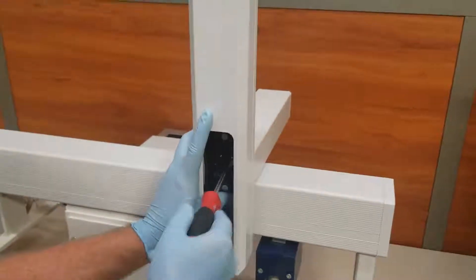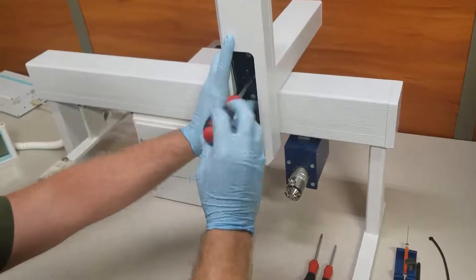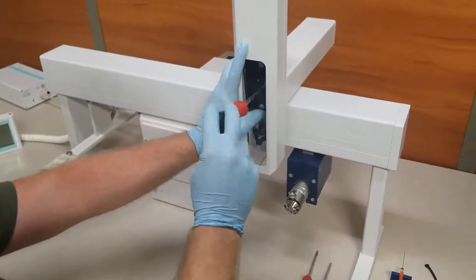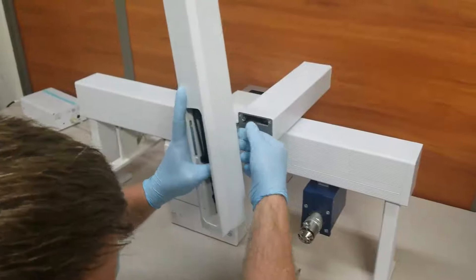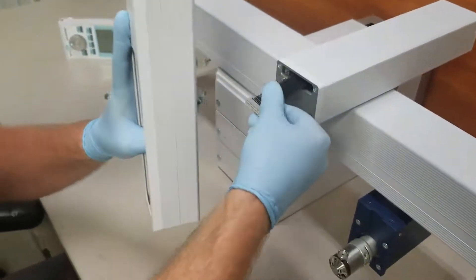After having a firm grip on the injection head, remove the screw, and by gripping the gray connector, gently pull and disconnect the wiring.